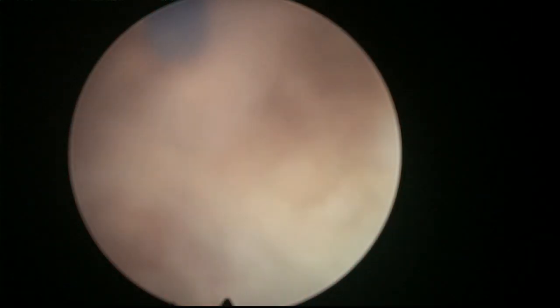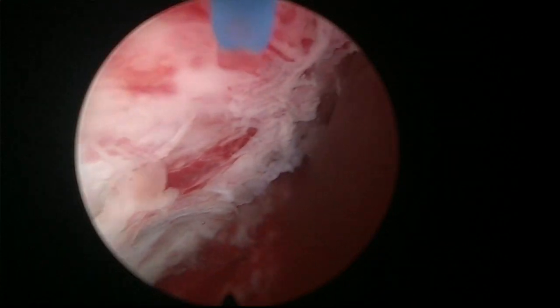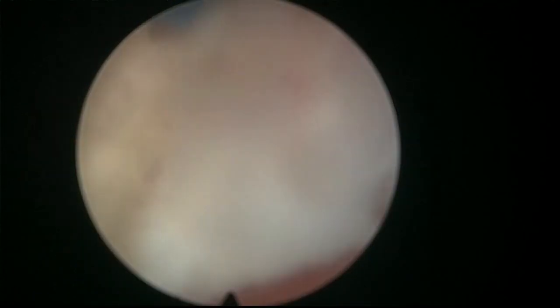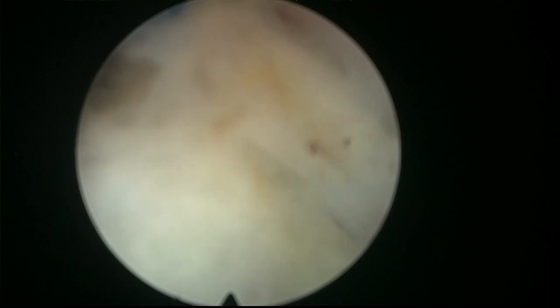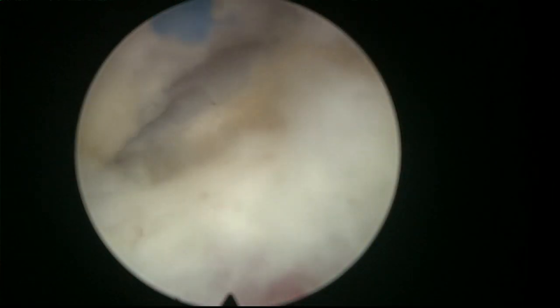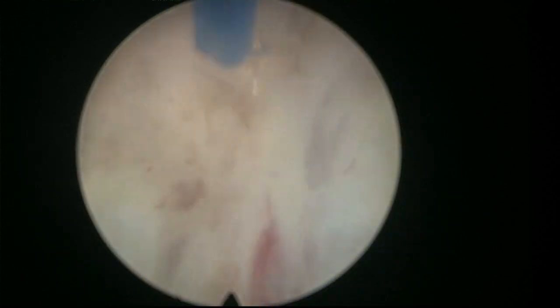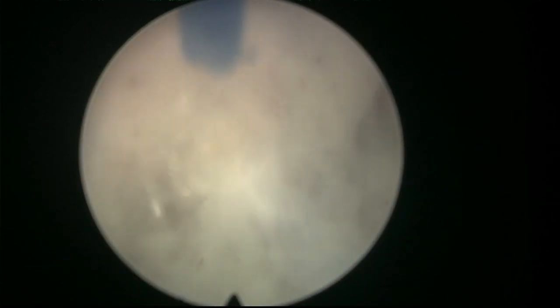And the visibility is not so good. Okay. The water is not particularly low, so we have these apical bleeders. Okay, so this is sphincter. This is the white line we marked. And again, I'm going to cut on the tissue a little bit, on the prostate. Here we are following a good cut, and then now we look for the good plane. Now this is a good plane, so we gain a lot of access by doing that incision on the prostate.